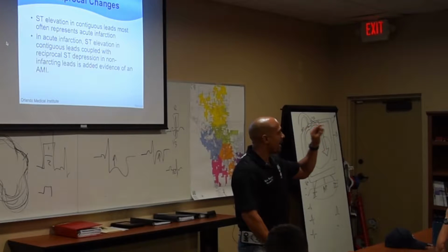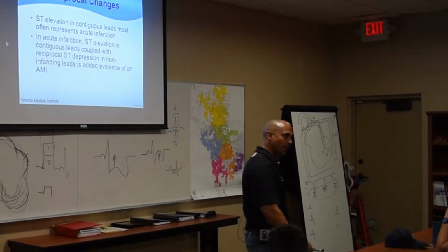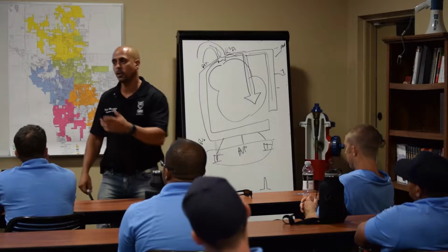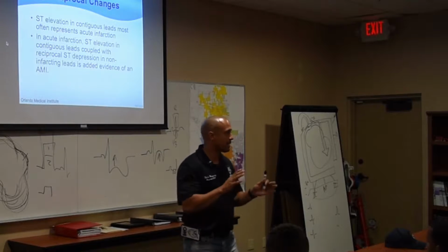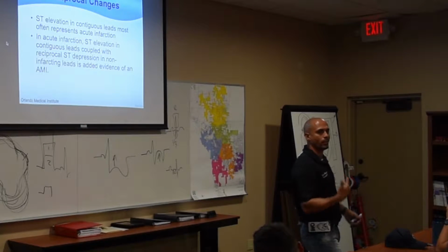So anytime you have ST depression in V1, V2, you've got to say to yourself, is that ischemia? Or can that be reciprocal to a posterior wall MI? The only way you know that is if you do what? Move leads to the back. Make sense?